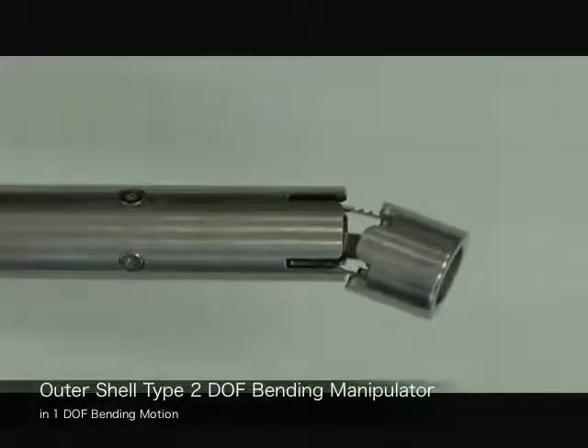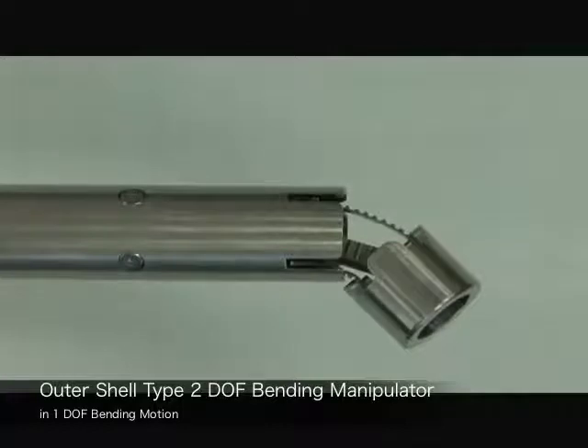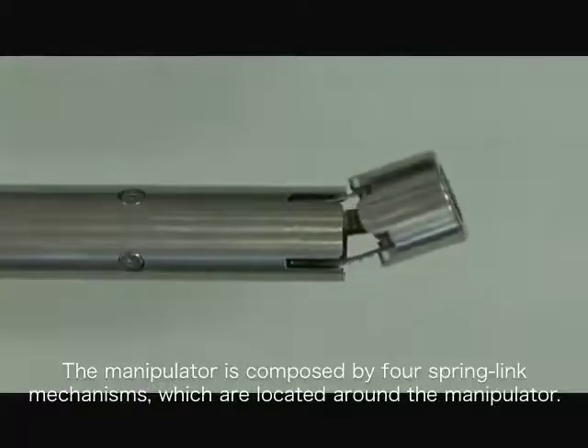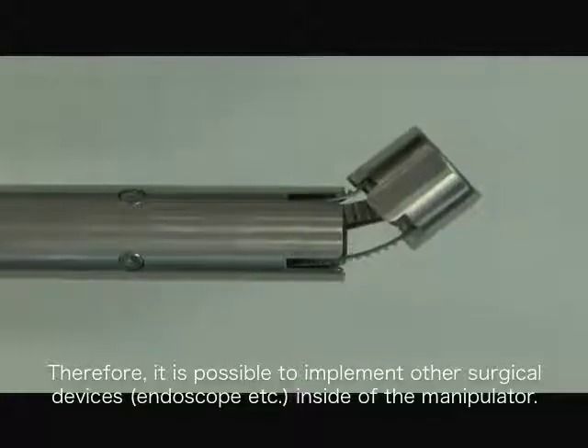Here is the outer shell type 2 DOF bending manipulator in one DOF bending motion. The manipulator is composed of 4 spring link mechanisms which are located around the manipulator. Therefore, it is possible to implement other surgical devices inside of the manipulator.